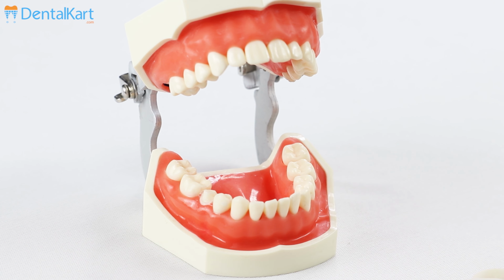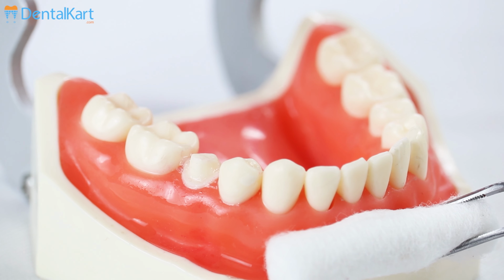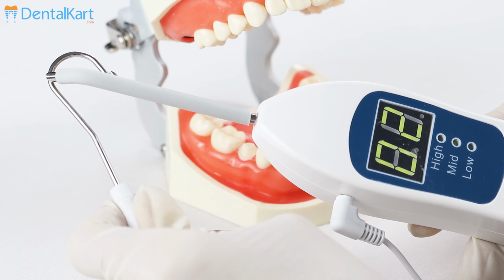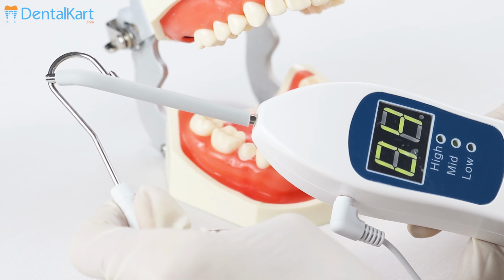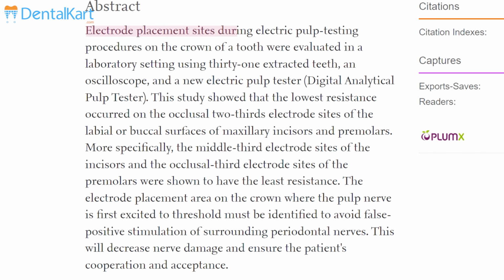Explain the test procedure to the patient to reduce the patient's anxiety, as it can result in giving a false reading. Isolate and completely dry the tooth or the area where the test needs to be performed. Then check the proper functioning of Waldent electric pulp tester before using. Before performing the electric pulp test on the required tooth, perform the electric pulp test on the control tooth.